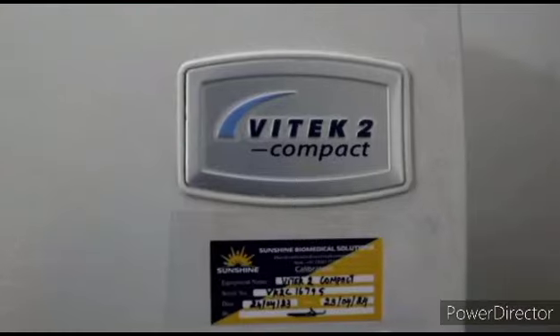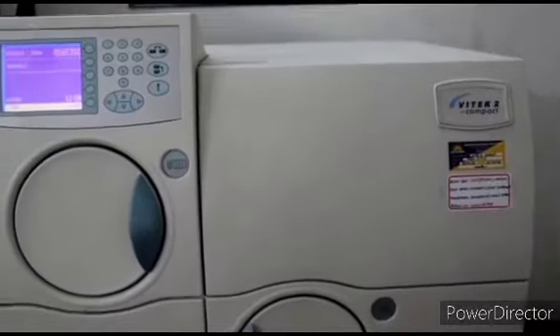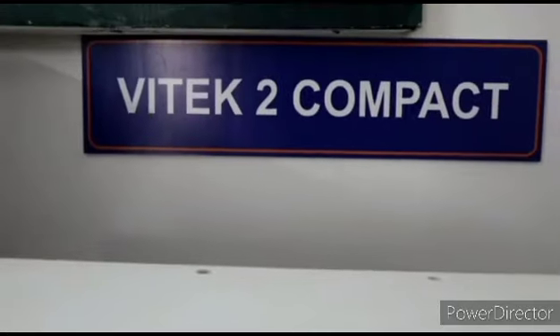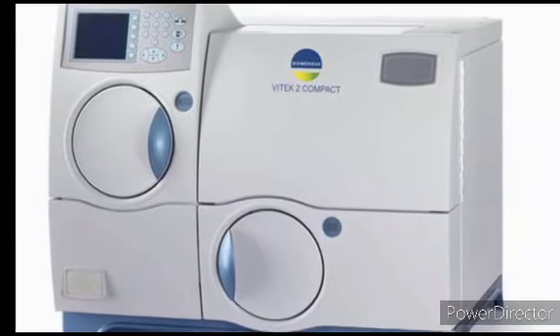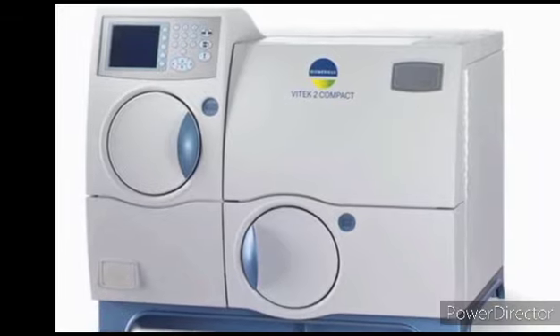Here is the Vitek 2 Compact system, which is used to identify the pathogens at species level. Moreover, it gives the minimum inhibitory concentration level of antibiotics according to the CLSI guidelines. Minimum inhibitory concentration is nothing but the minimum level of antibiotic used to kill the particular pathogen. The system works under the principle of colorimetry and turbidimetry.